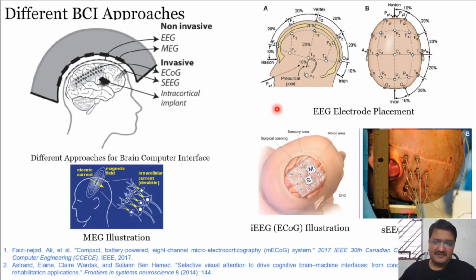If we are recording using EEG, it's simple. You are not supposed to open your skull or anything. Once you have a proper headband or any kind of device, it is very easy for even a semi-skilled person to take the recordings and check them further. So why should we open the skull and go intracranially, or even deeper into the brain, to measure the response?